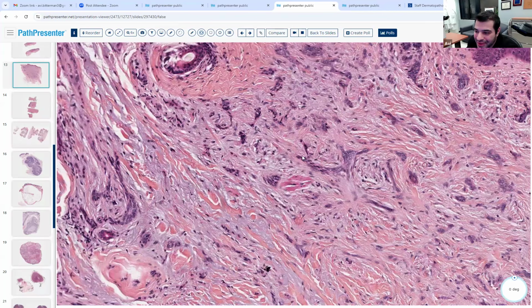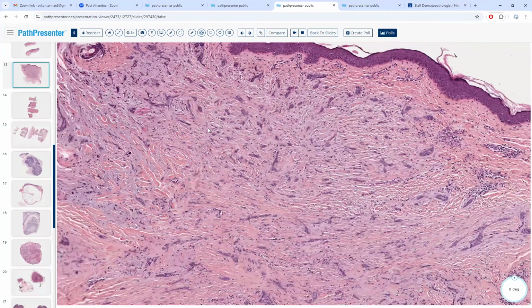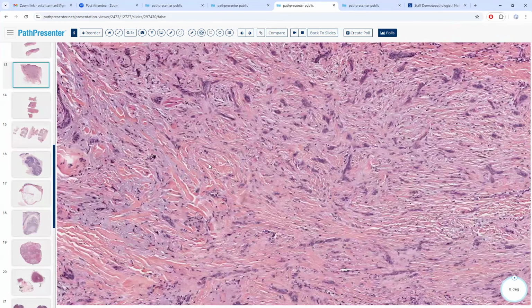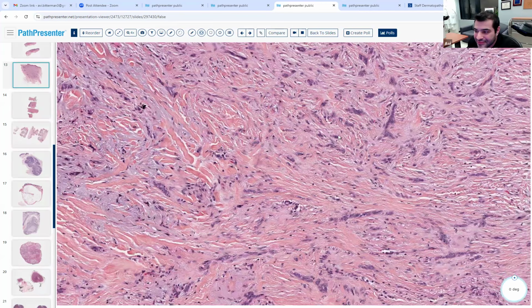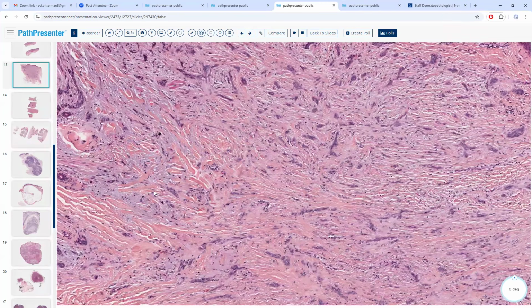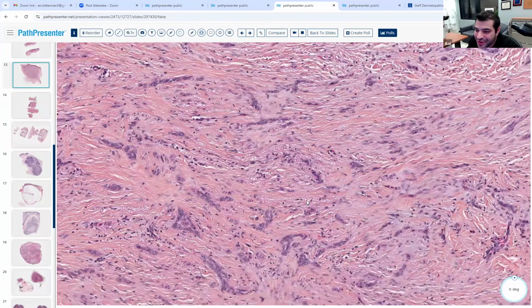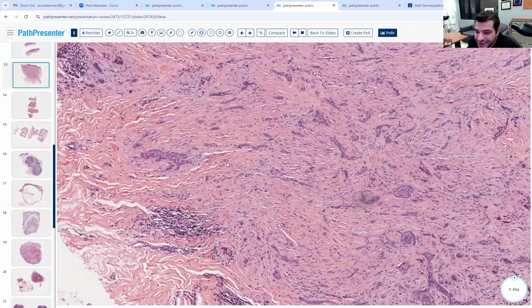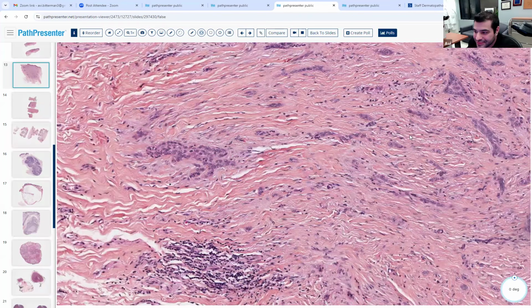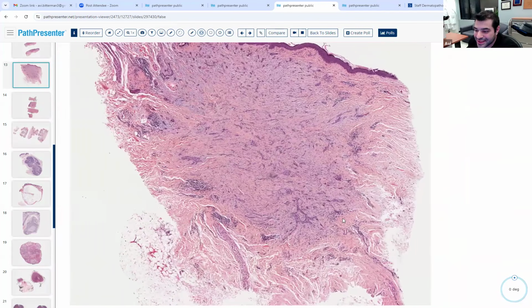I mean, there's a tumor and then there's fibroblasts in the background, and it has what kind of stroma? Yeah, the stroma looks weird. Is it like very myxoid? I agree. So I guess the mucin gives a big clue. Yeah, there's a myxoid stroma to this. So tumor and myxoid stroma. Is it circumscribed? Yeah, fairly well.